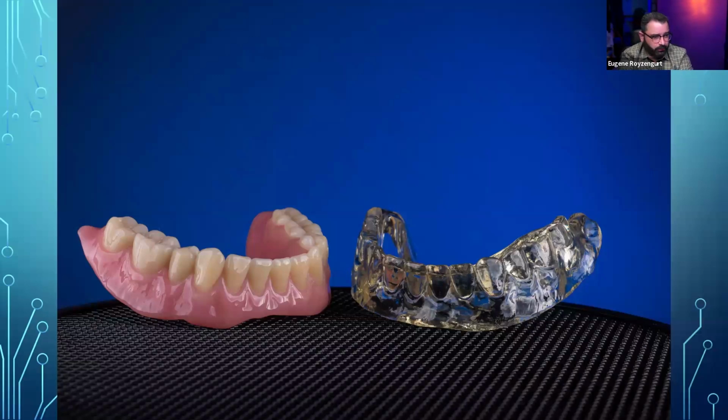Okay. Actually, no, I think I'm lying. No, I'm a big liar. Sorry. This particular one, the doctor requested denture and a surgical guide together. I don't think this was an immediate. But nevertheless, what I'm trying to show you guys is that surgical guides can be done analog.